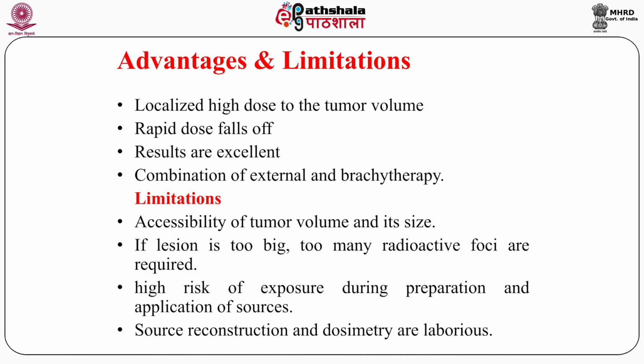The most important part in brachytherapy is to plan the case accurately. If the planning is not proper, dose delivered to the tumor will be different. It may be very high, it may be very less.